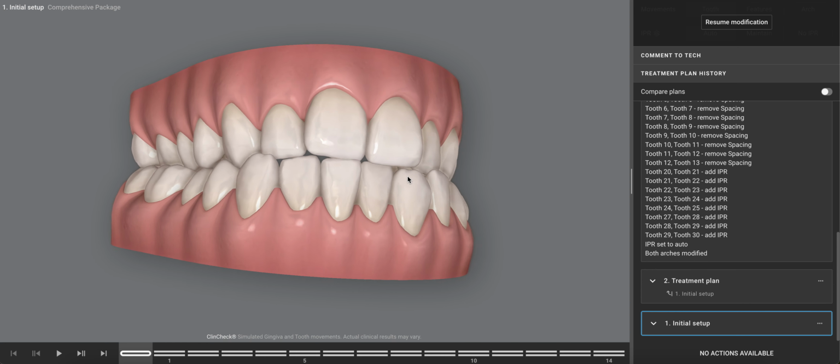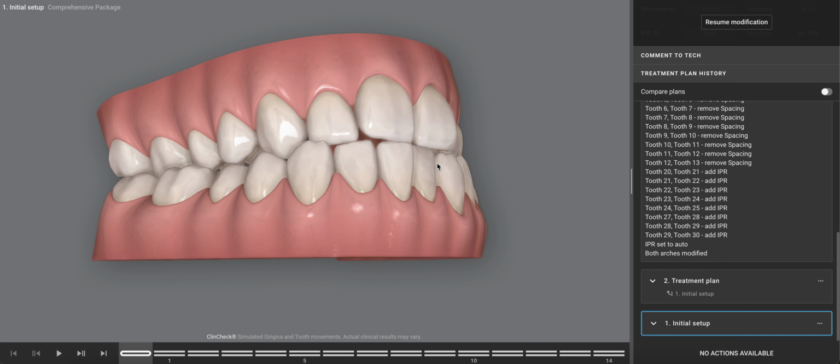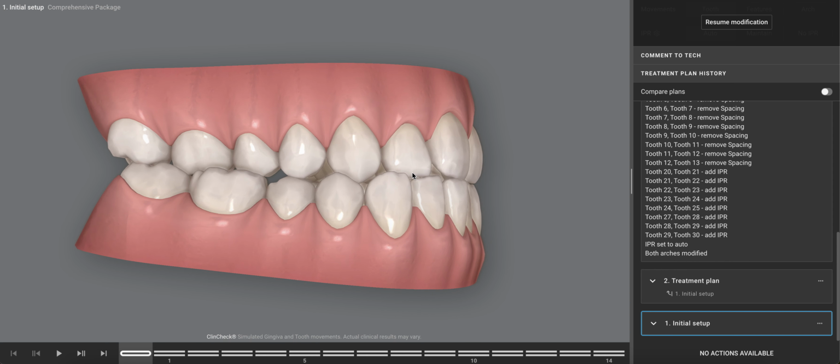Now, one could easily say surgery would be better to achieve those goals, and I wouldn't disagree with that. We have to ask the honest question: does this patient need to go through all of that to achieve that endpoint? I don't know if I have the answer to that, but in a patient who's not interested in it in the beginning, I'm very comfortable doing this more camouflage treatment.